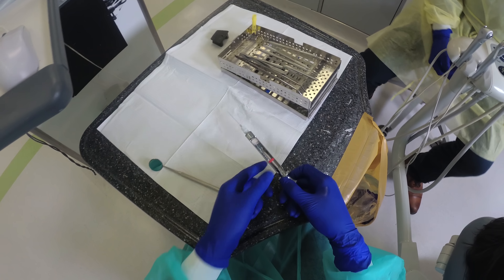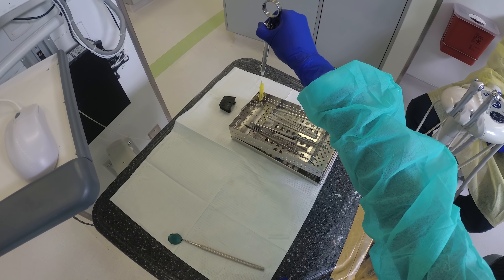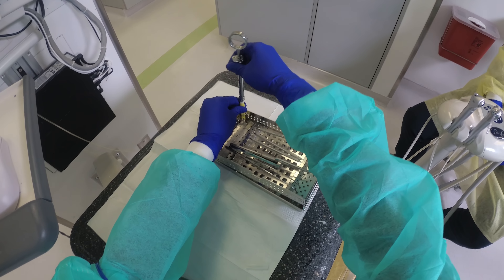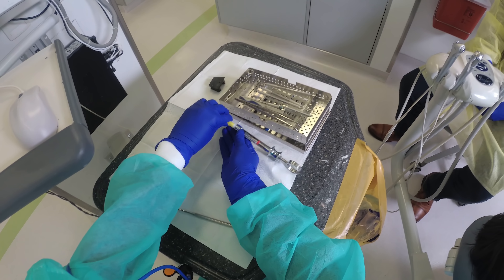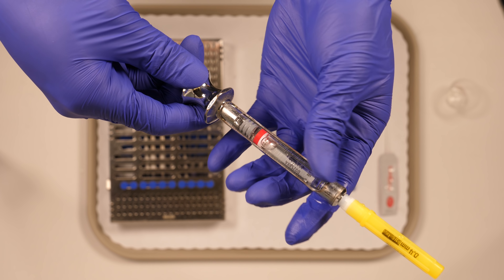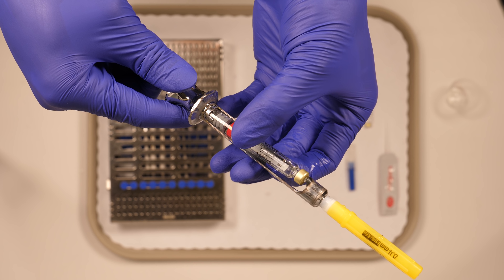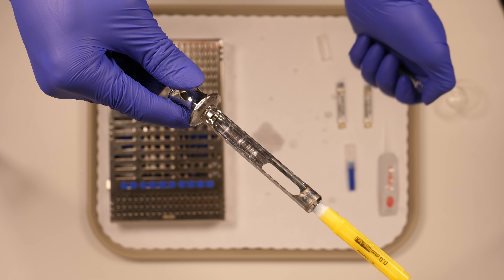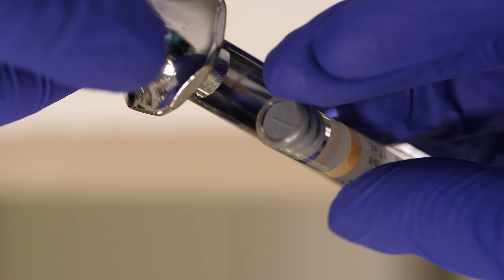Alternatively, there is a needle cap holder designed in many cassettes that you may use. If you need to exchange an anesthetic cartridge, pull back the syringe after twisting the thumb ring and ensure that the needle is no longer inserted in the cartridge. Push the cartridge from the back of the syringe and pop it through the window. Insert a new cartridge and proceed accordingly.